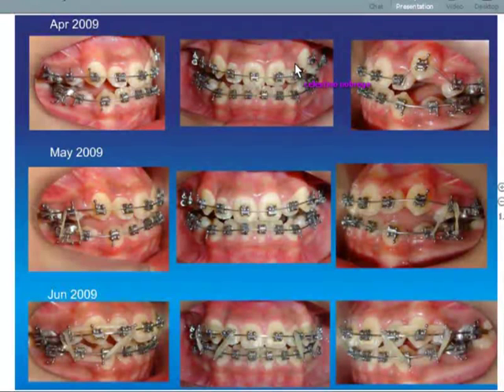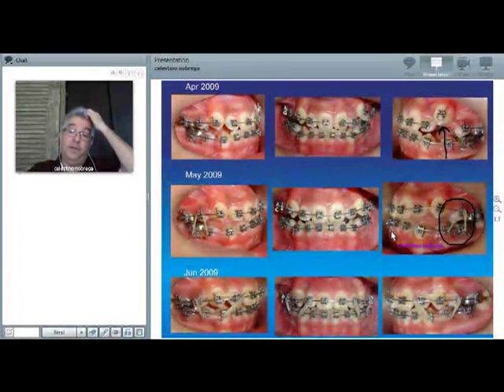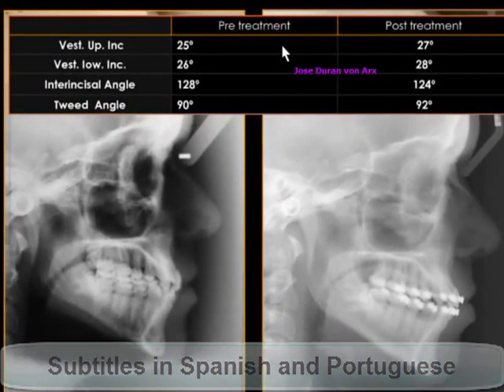Here we have from the beginning the middle situation. We have the 16 arch wire engaging also the upper canine. And then one month later, we are using a rectangular arch wire in the lower. That's how we have the result — the upper incisor goes from 25 to 27 degrees.